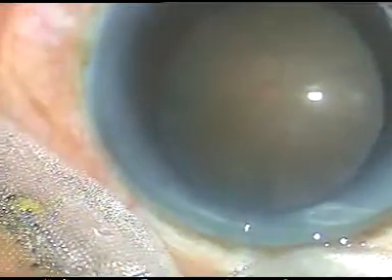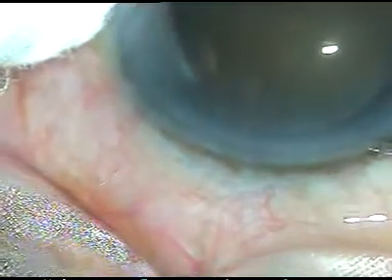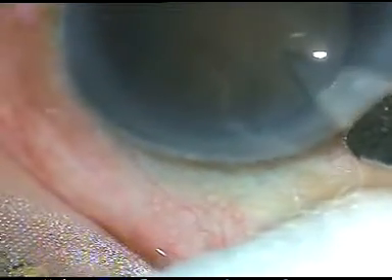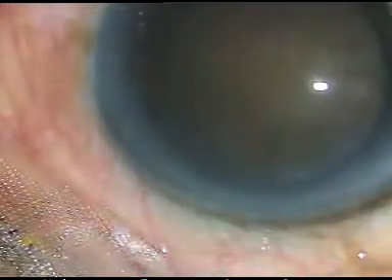Dear colleagues, I had several challenges in this case: hard cataract, shallow anterior chamber, mid-dilated pupil, and weak zonule. Let us see how the surgery went on.